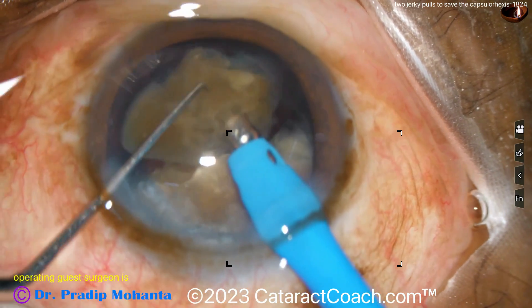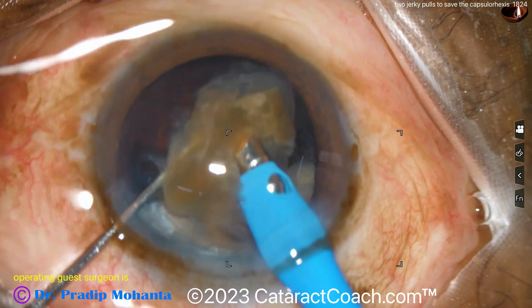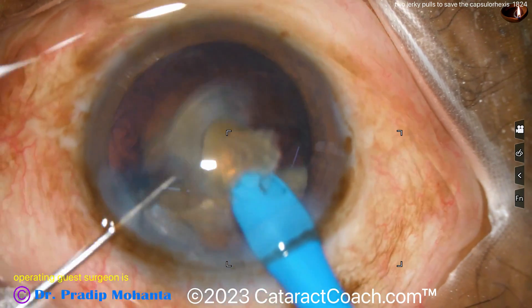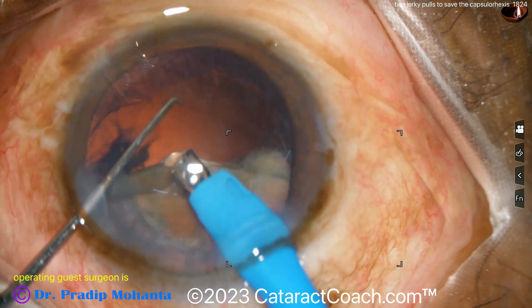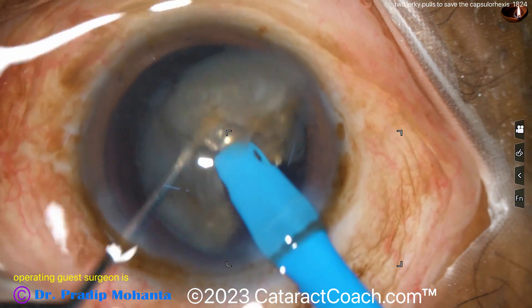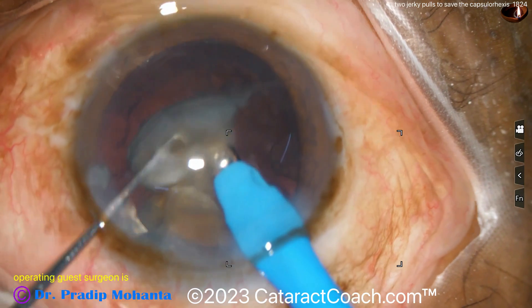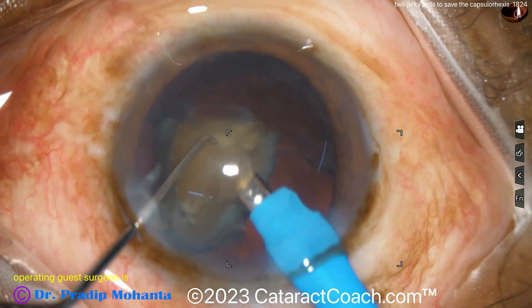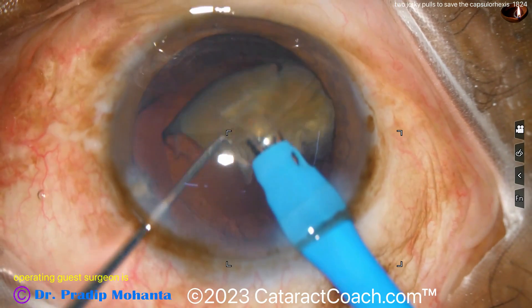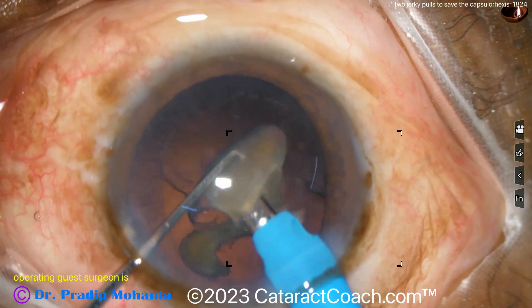Obviously Dr. Mohanta is a fantastic surgeon — this looks like a beautiful case. Keep in mind this idea of two jerky pulls. Sometimes you can't get that little maneuver done, and this two jerky pulls method works great — plus it's more fun to say. The first half is being removed pretty easily. Being cautious here to minimize total phaco energy and make sure you don't cause a phaco wound burn. You really have to spend time to separate out those fibrous pieces. Each quadrant's apex — representing the central endonucleus — tends to be the densest and requires the most phaco energy. At the end, remember there is very little cortex remaining, so be cautious that the posterior capsule doesn't come up and cause issues at the phaco tip.